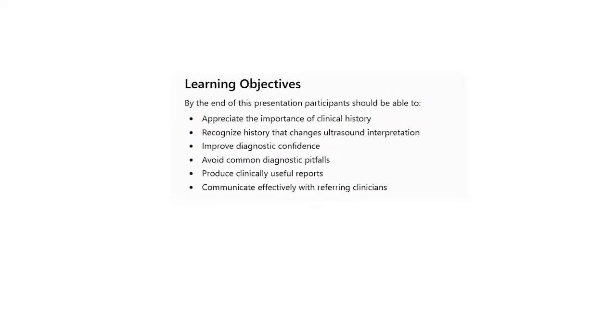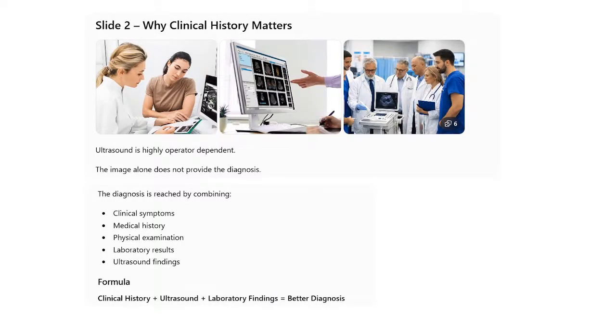The objectives of this presentation: by the end of this presentation, participants should be able to appreciate the importance of clinical history, recognize history that changes ultrasound interpretation, improve diagnostic confidence, avoid common diagnostic pitfalls, produce clinically useful reports, and communicate effectively with referring clinicians. So why does clinical history matter? Why should we bother ourselves with clinical history when doing ultrasound?